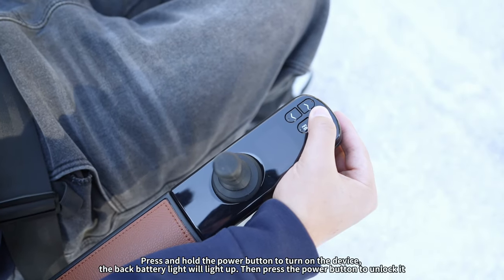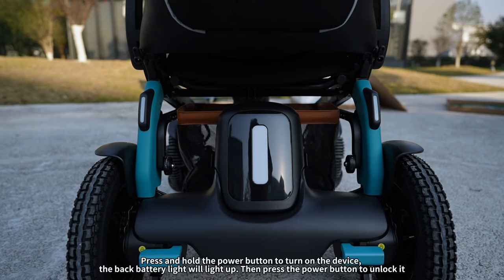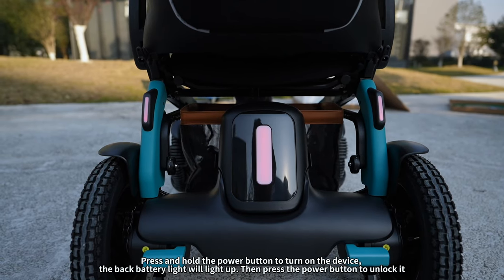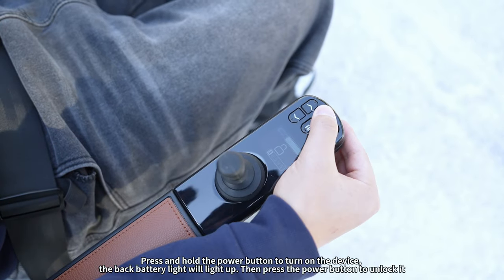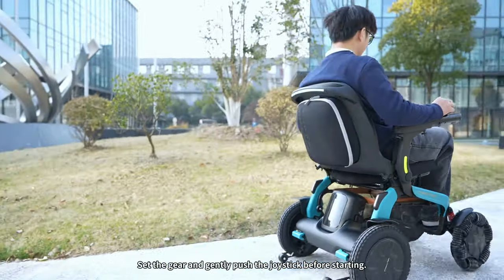Press and hold the power button to turn on the device. The back battery light will light up. Then press the power button to unlock it. Set the gear and gently push the joystick before starting.